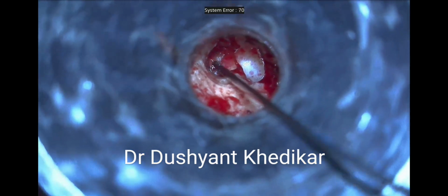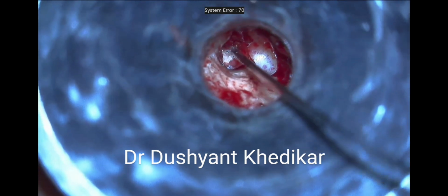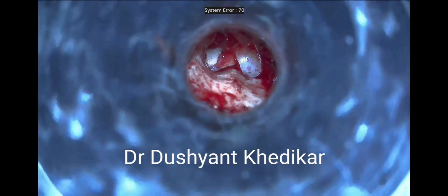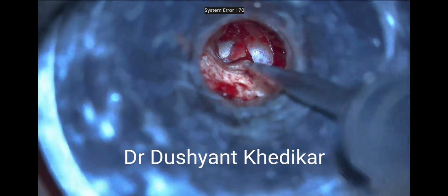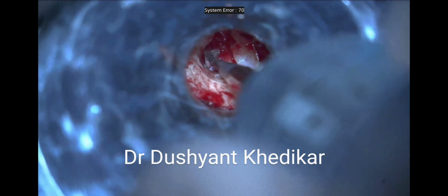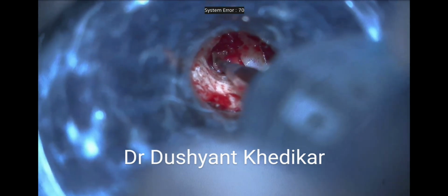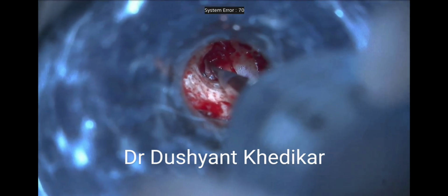After disarticulating the incudostapedial joint and cutting the stapedius tendon, crurotomy is done and the stapes suprastructure is removed completely to expose the oval window area and the footplate completely. Just now, you saw the removal of mucosa over the stapes footplate area. This can alternatively be done with the help of blunt instruments.